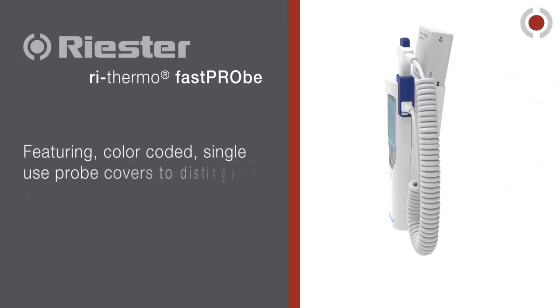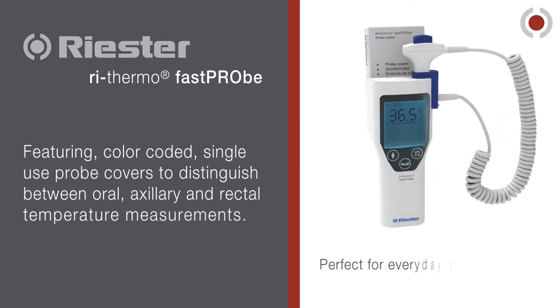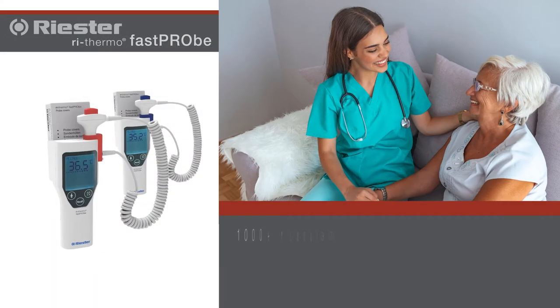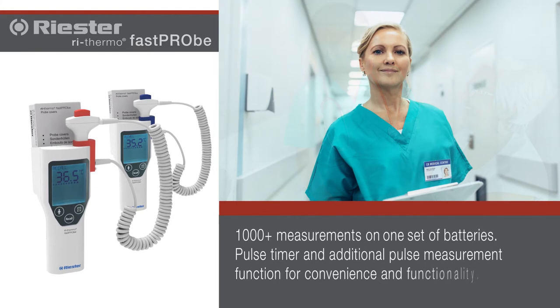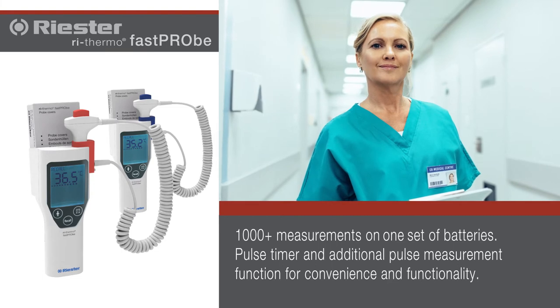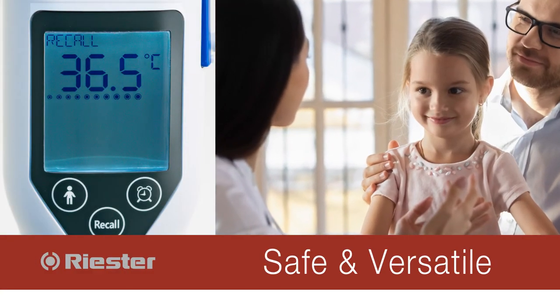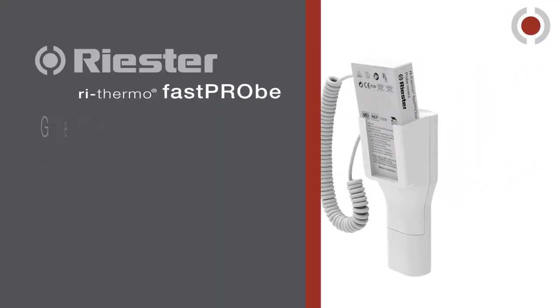Featuring color-coded ReSTER single-use probe covers to distinguish between oral, axillary, and rectal temperature measurements. 1,000-plus measurements on one set of batteries, pulse timer and additional pulse measurement function for added convenience and functionality, and a large backlit screen with measurement progress bar.